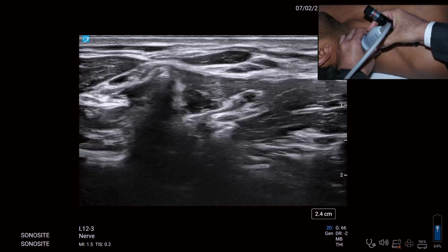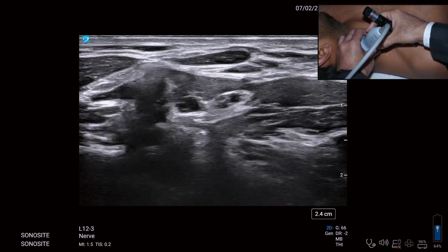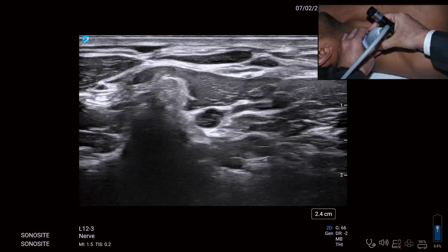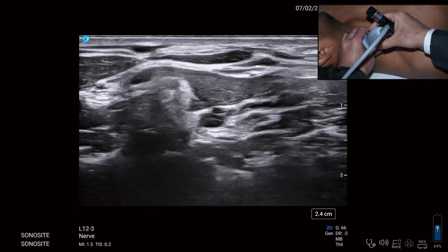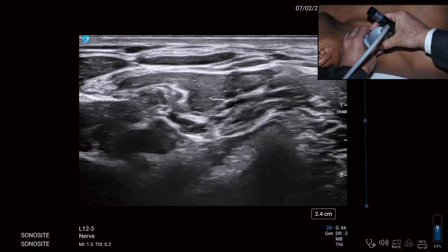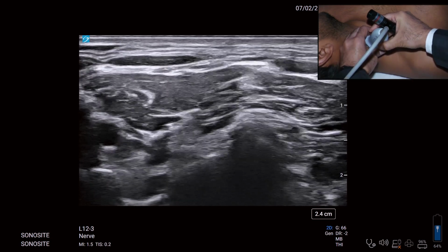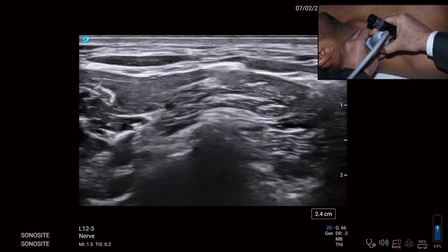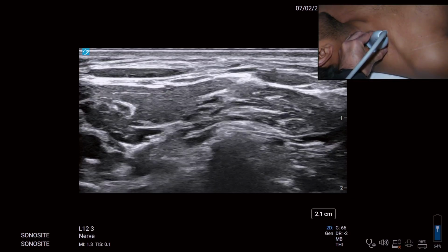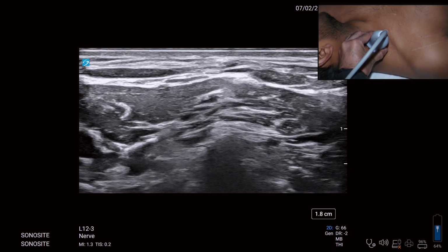Okay. In this case, C5 is split. Can you appreciate the C5 getting split? Yeah, the C5 is split and the C6 is also split at the beginning. Yeah. C5, C6 split, can you appreciate? Everyone? Okay. Then C7 would come out. Okay. Now observe, can you decrease the depth please? Now keep your eyes on this. Decrease the depth. Yes.